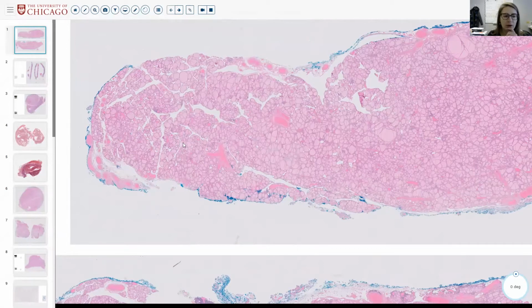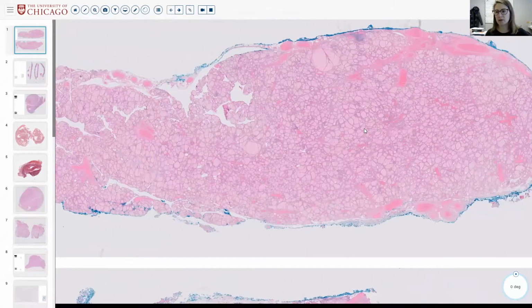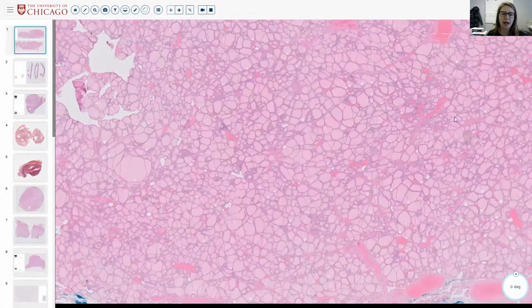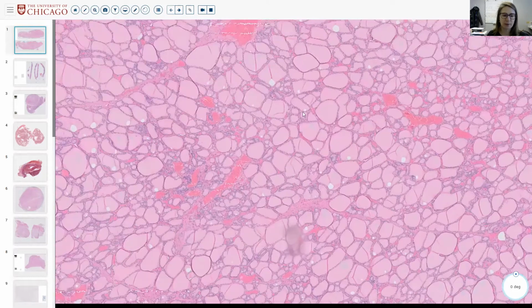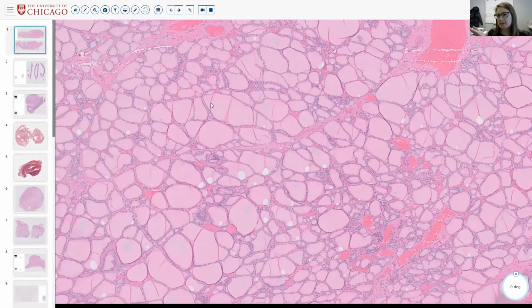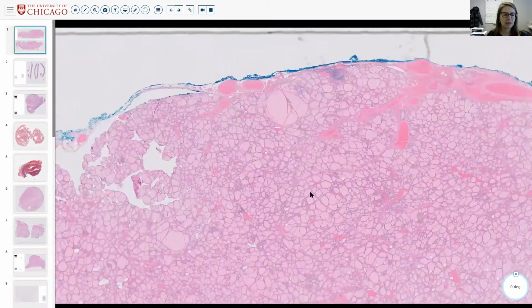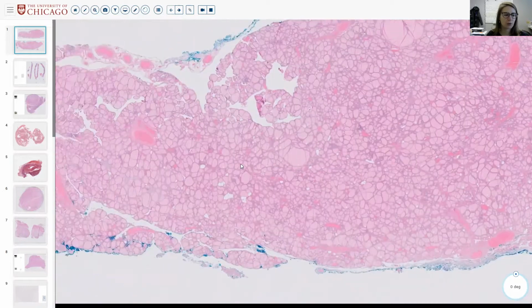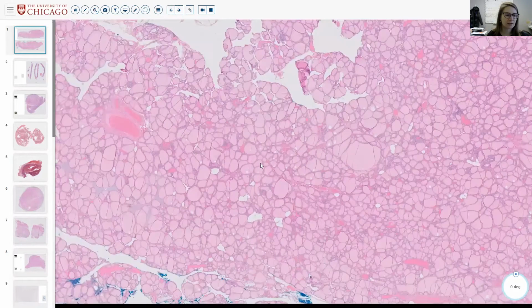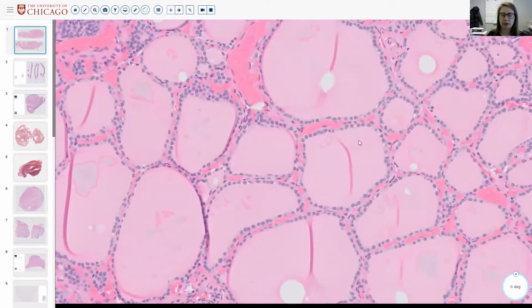As we know, there are both C cells and thyroid follicular epithelial cells that compose the thyroid, but of course the follicles are the most prominent in number, and you don't really see the C cells on normal H&E unless they're hyperplastic. We can certainly see the normal follicular cells. There's generally a homogeneity to the size and even shape of the follicles. They're uniform and moderate in size. And so that will be our comparison point for when we call something micro or macrofollicular.